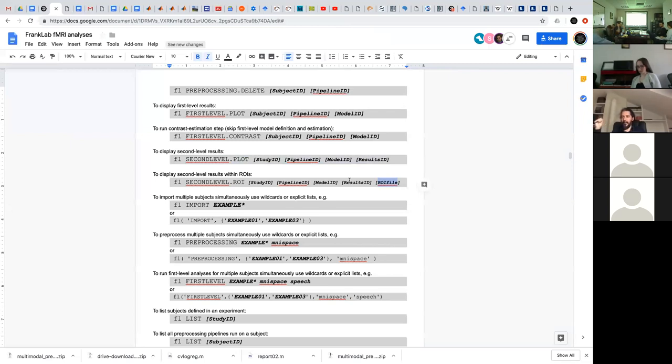It'll be different. You can say, well, it's the same because once you warp everything to the FS average space, it ends up being the same patch on that surface. Still, once you map it back to the individual, it will differ.